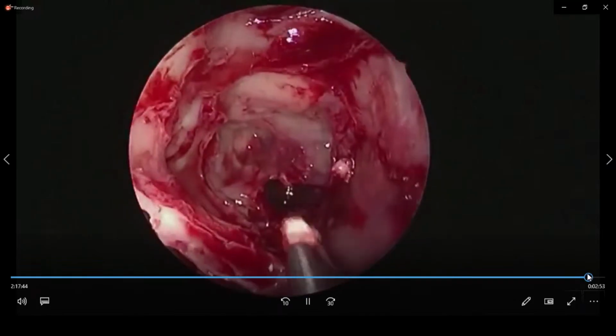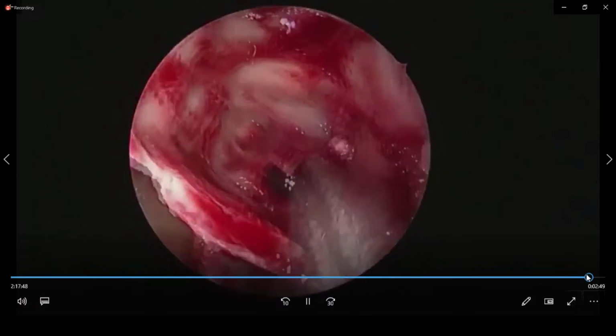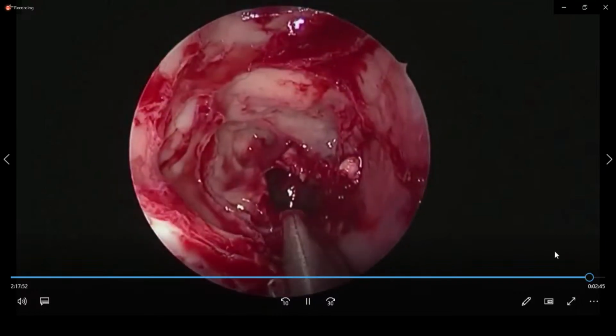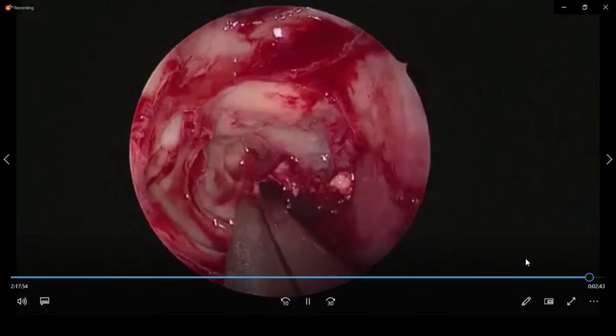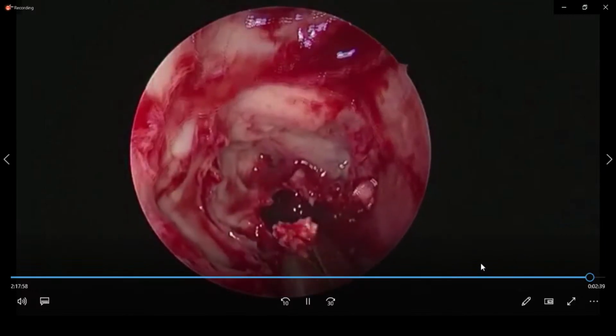This is the party wall with the posterior ethmoidal cell. You can widen under vision. So you are not supposed to do any sharp instrumentation inside the sphenoid sinus. See this? No sharp instrumentation inside.